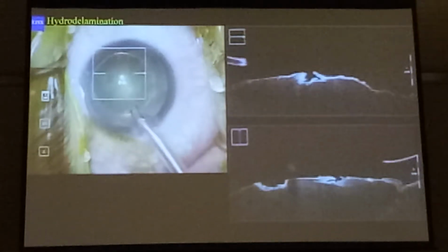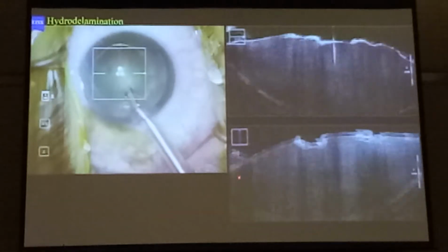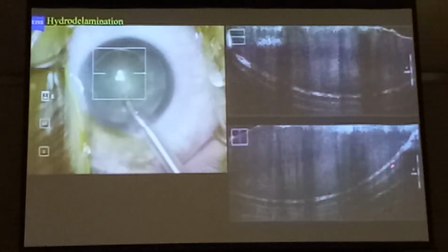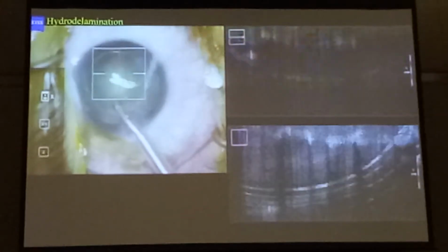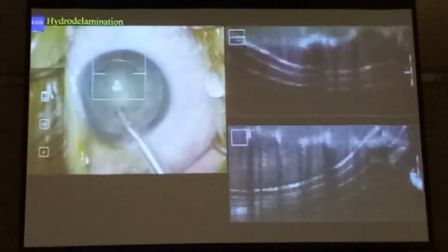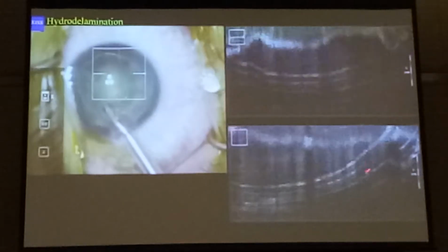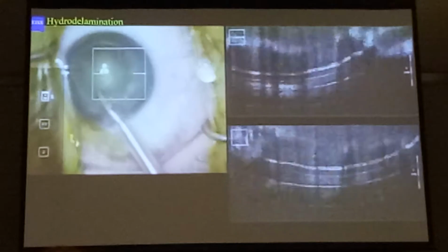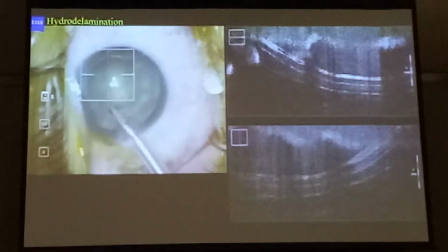You can see the resolution is pretty good. Then as I go deeper, you can see the nucleus now. See that? There's the nucleus. Isolated. There's my hydrodelamination ring. And there's some hydrodissection layers down there. So for now, we're able to see the golden ring, the effect of the golden ring and hydrodelamination in 3 dimensions. You can see actually the waves go in many, many layers to separate the nucleus from the epinucleus, and the epinucleus from the cortex, and the cortex from the posterior capsule.